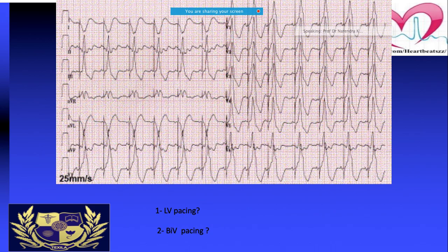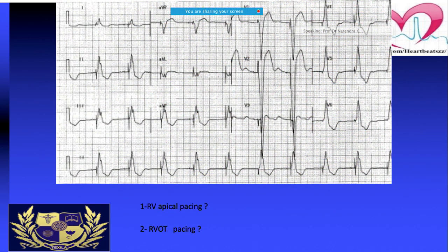The dominant R wave from V1 to V6 is consistent with basal LV pacing. LV pacing in subsequent figures was performed from the coronary venous system — from the coronary sinus. In this next ECG, pacing is done from the RV outflow because there is left inferior axis and left bundle branch block, and there is no dominant R wave in V1.